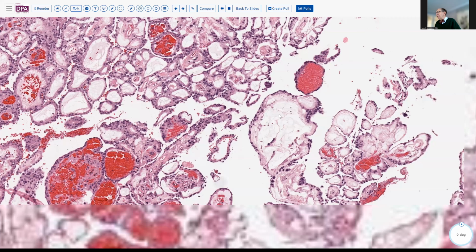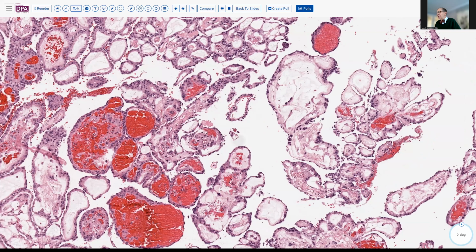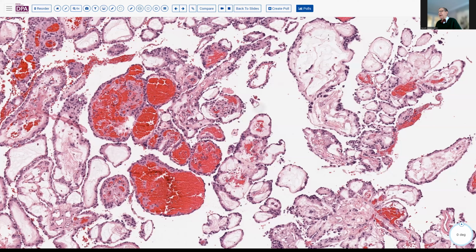As you can see, you've got the myxoid tissue and the cores, and it's got a very papillary architecture. And cytologically, phenotypically, it's an ependymal tumor, because these cells will be positive with GFAP and negative with cytokeratins. So it's not an epithelial-derived tumor.